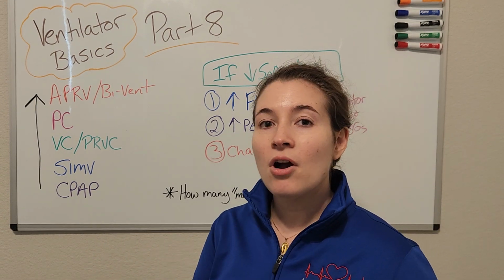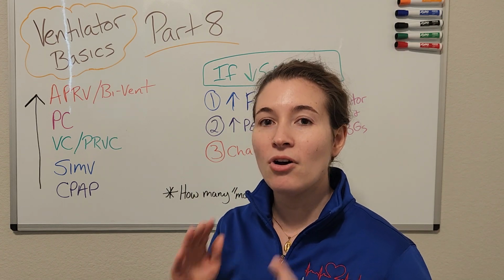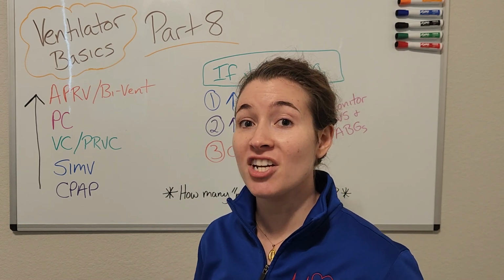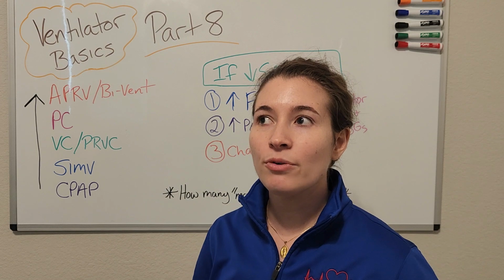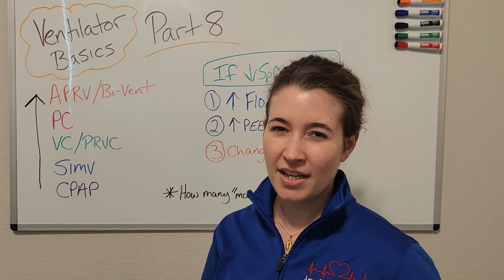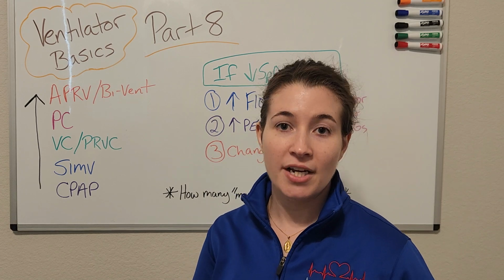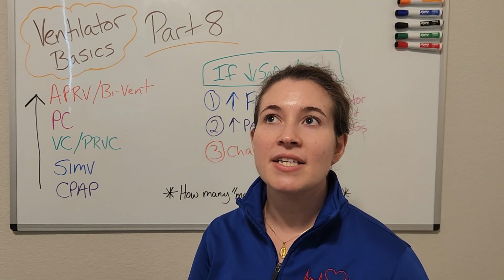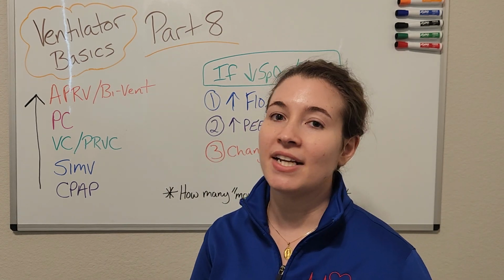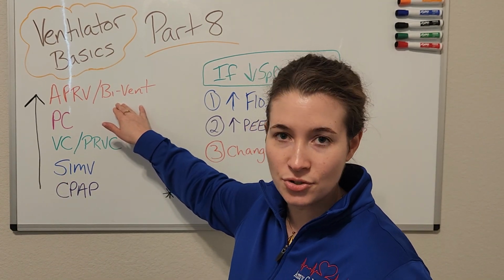Now, an important concept that you need to know as a nurse at the bedside is how sick is your patient, but also what tools do we have available to us to help our patient if they are not doing well. And I like to refer to this as how many moves do I have to make? Okay, and let me explain that a little bit further. So let's say you just got a report on your patient and you hear that your patient is on the APRV settings on 100% oxygen and their other settings are maxed out. They're pretty much at the very top of what we can do for them.